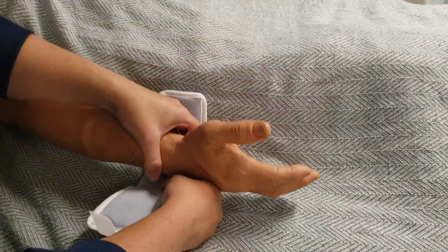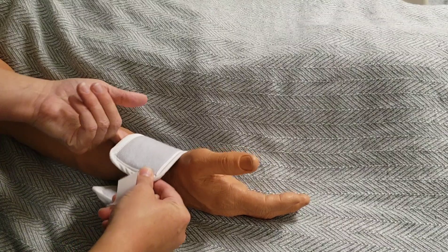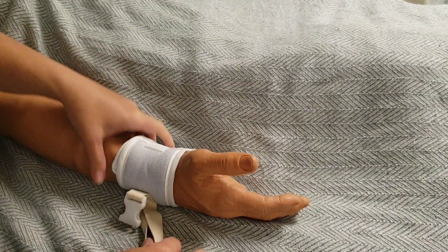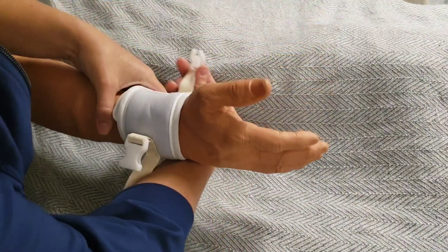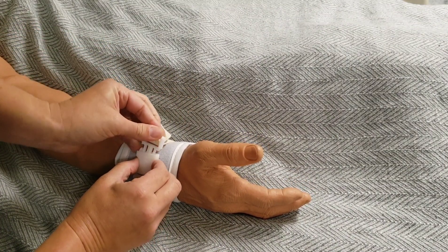Apply the soft wrist restraint to the patient's wrist as demonstrated. Place your finger under the cuff as you wrap it in place. You want to ensure that the patient has adequate circulation and it is not too tight. Secure the restraint using the strap and buckle as shown. Check one more time that it is not too tight.